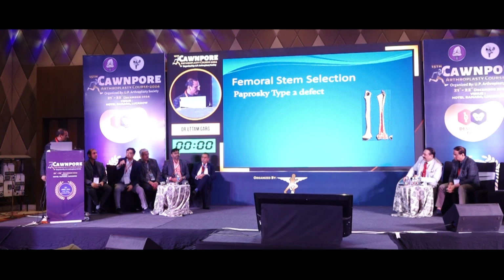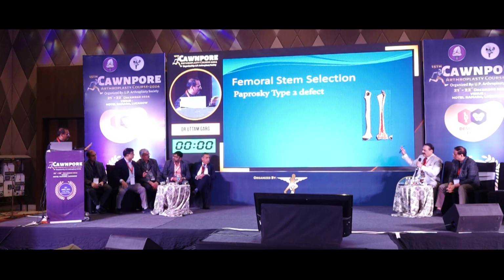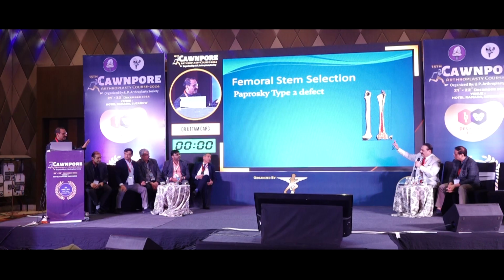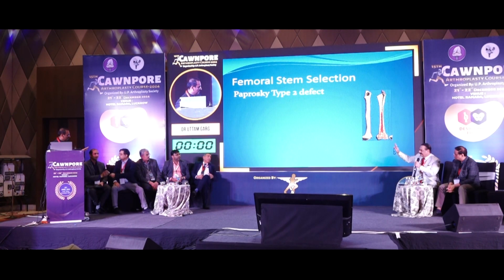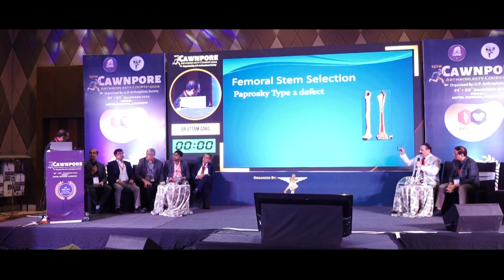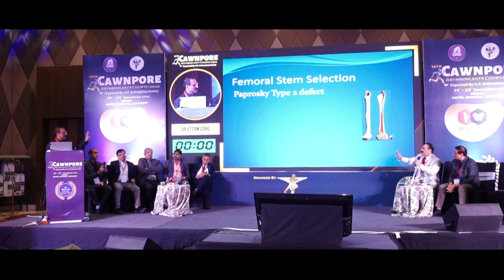I think the Wagner stem will do very well here. Yes, sir. Typically, I would love to use the distal Wagner fixation. So after doing ETO, it has to be diaphyseal fixation. Dr. Shub, any distal fittings? Tapered distal conical fixation, taper stem fitting. S-ROM, proximal fitting, no? Out of question.